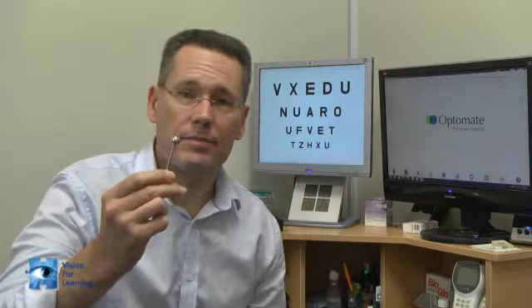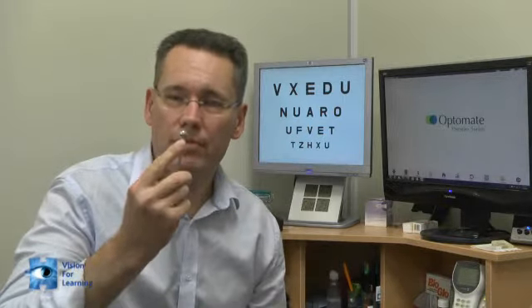The second test we're going to look at is the ability to turn our eyes inwards, which is what optometrists refer to as convergence. So this test is done with both eyes open, and to do this test, ask the student to look at the ball on the tip of the wand that comes in the kit, and ask them to tell you, as you move it closer towards them, when it goes double or they can see two of them. Again, start by holding the wand out at about 50 centimetres and slowly move it closer. Let me demonstrate this one for you.